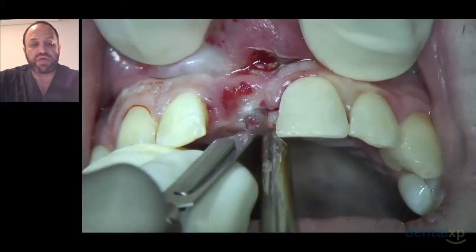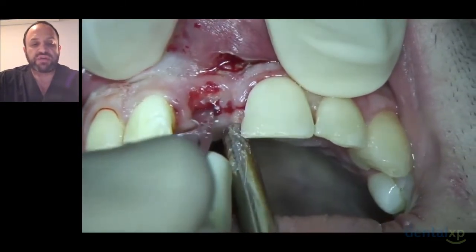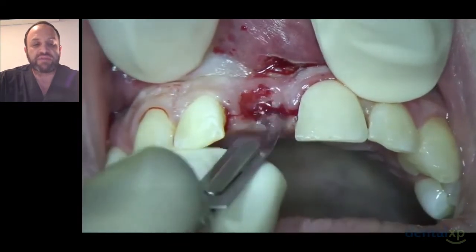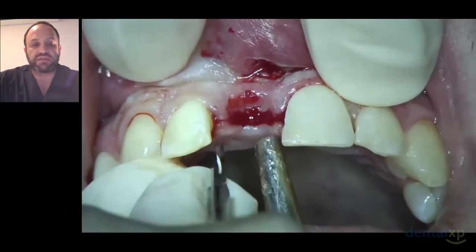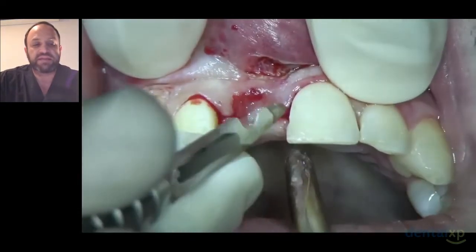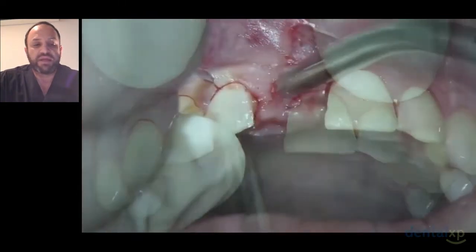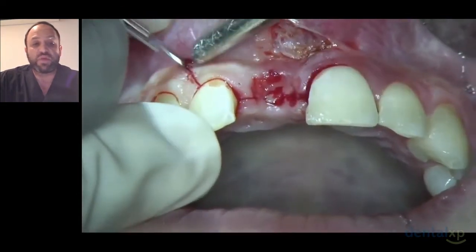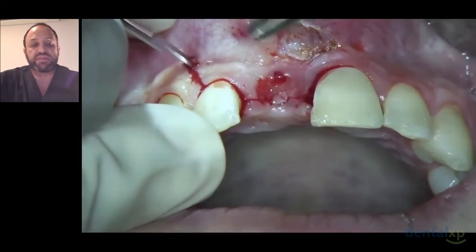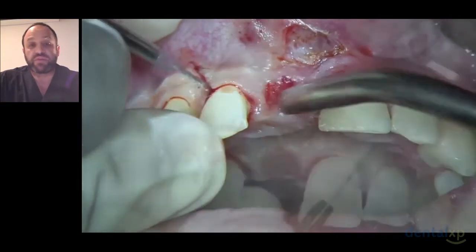You'll know if you're doing the online education with Dental XP, the externship, in our flap design lecture, we talk about how important the midline incision is for healing, and the studies that show that the healing is best when you do a midline incision. And here we're doing our releasing incisions, one tooth either side. The reason I'm doing one tooth either side in this case is that we're not using autogenous bone, it is a foreign material that we're going to be placing.